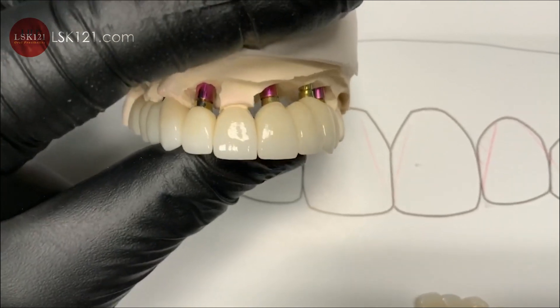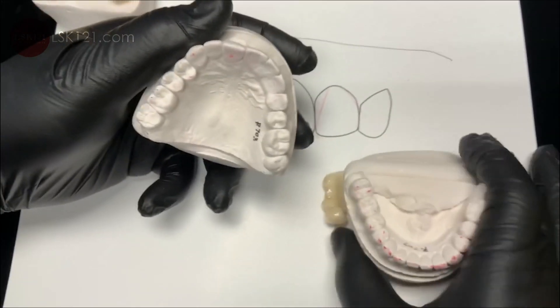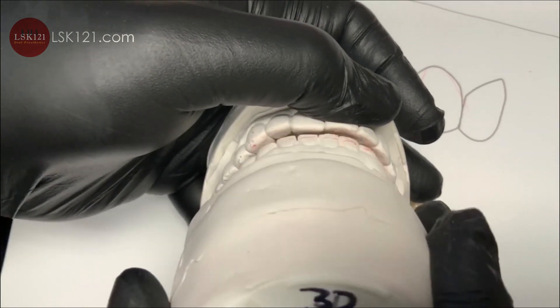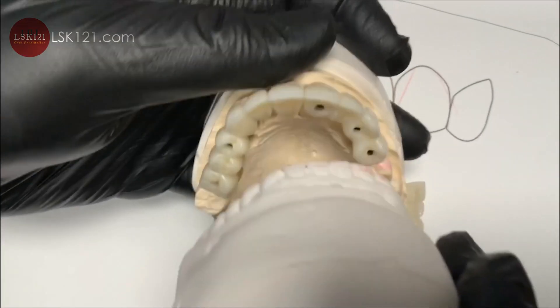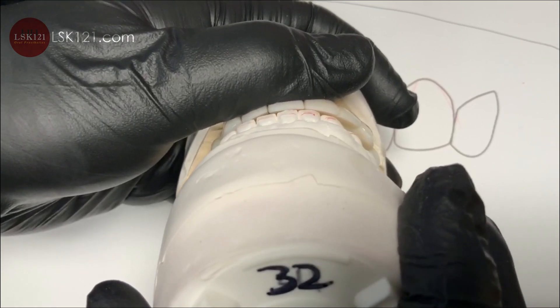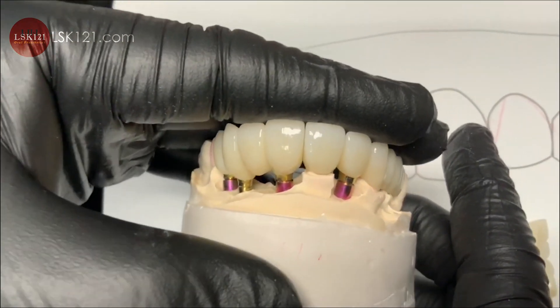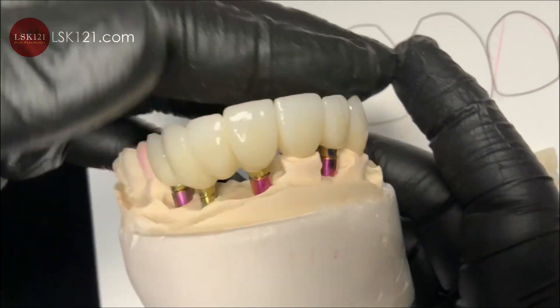I'd also like to talk about the pre-op: the pre-op had a really tight bite, but I like that there's room — freedom of movement. I gave them more grinding on the facial when the patient is protruding. I duplicated it like this with a little room so they can get movement easily after cementation.